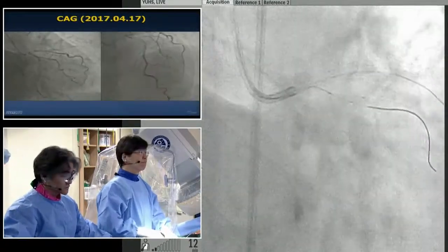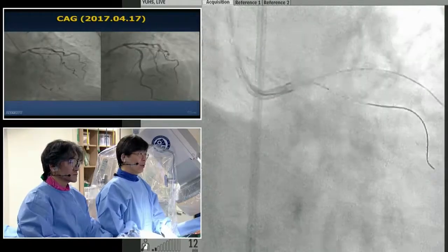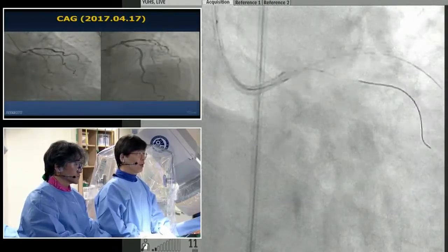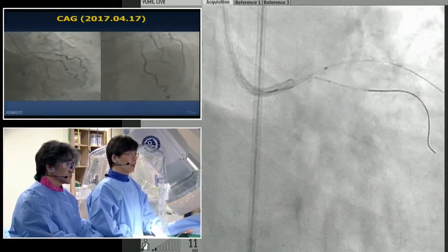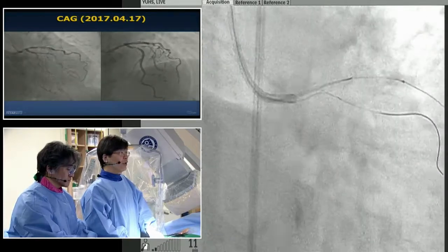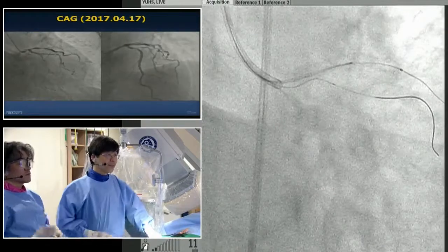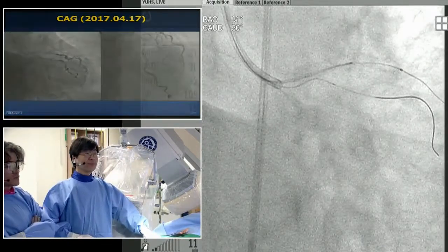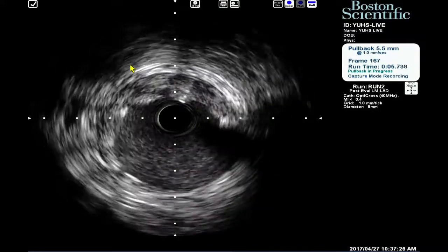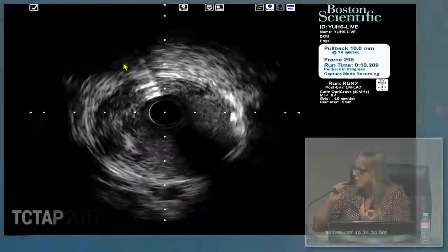If there is any change in hemodynamics, because so far we have not used contrast dye, we don't know about any compromise. You are really brave. I would be too nervous to do it like this. But there is no reason to be nervous. We have done the IVUS, you know where the plaque is, you know what will happen. To me, this is the beauty of imaging. You don't need to be nervous.